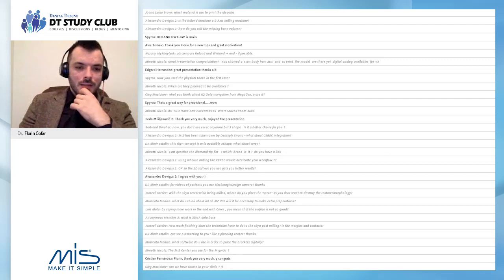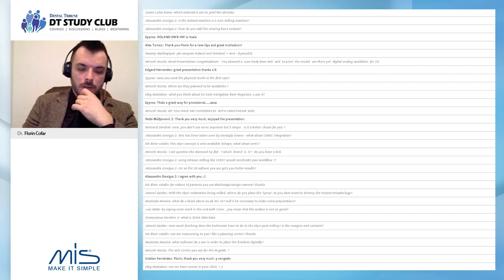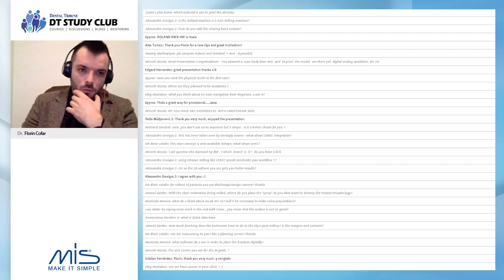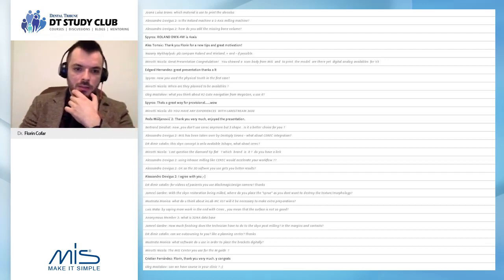Skin Concept is available on any system, it's just different workflows on how to use it, which means raw is one workflow. Skin, as Master Kano does it, where he places the composite skins in the mouth and then scans with Cerec, this is another way. And they all work, they're just different. Depending on the systems, you have different workflows.